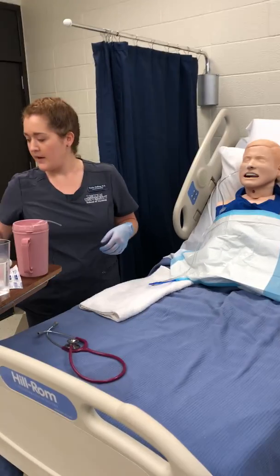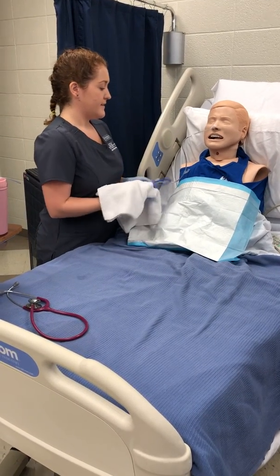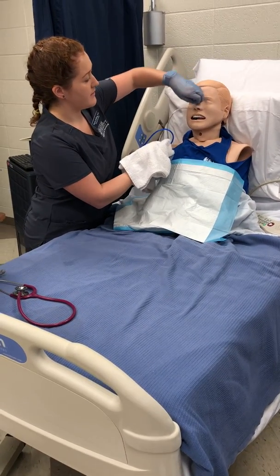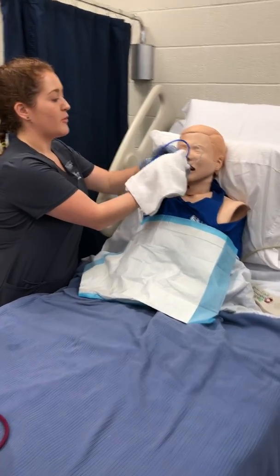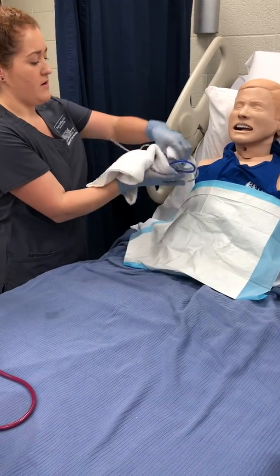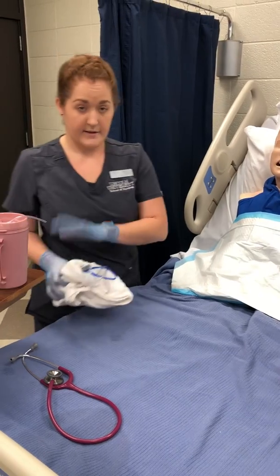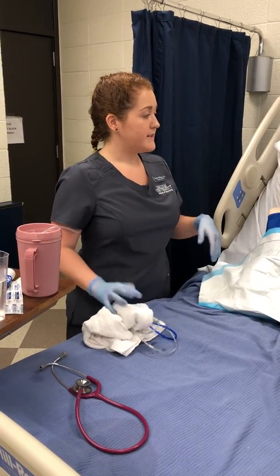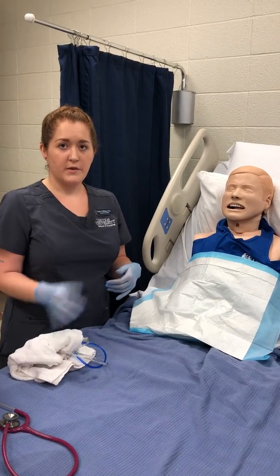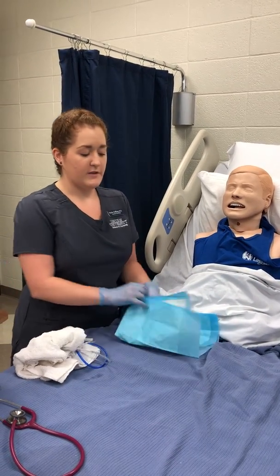Now that we've got all that, I'm going to instruct Fred to take a slow, deep breath, remove the tape, and I'm going to remove it in one fell swoop. Here we go. Good job, Fred. I'm going to discard all of that. I'm going to document how he tolerated the procedure, the amount of fluid that I inserted prior to removing the tube, and all other relevant data.